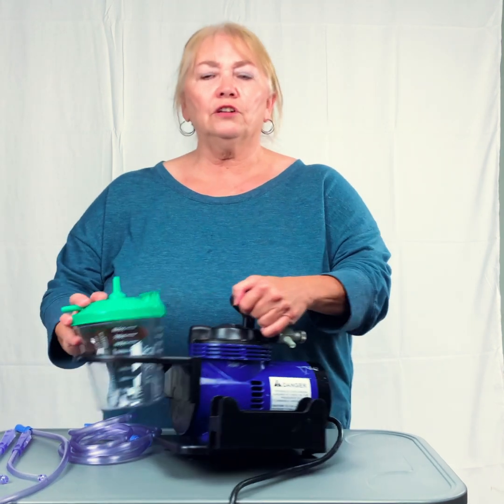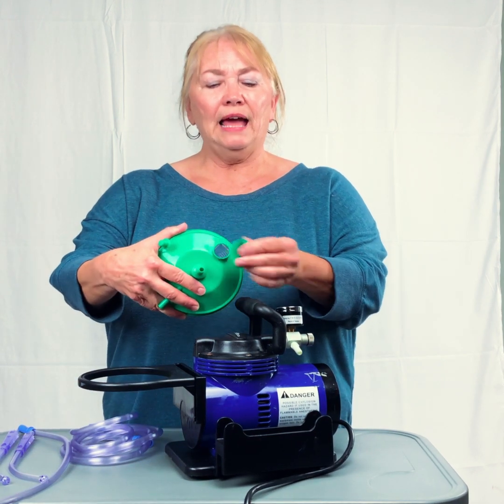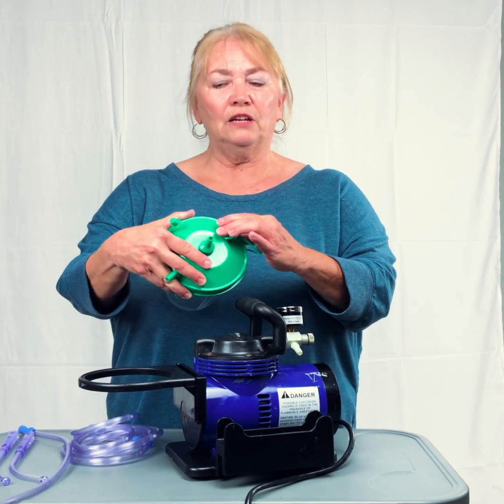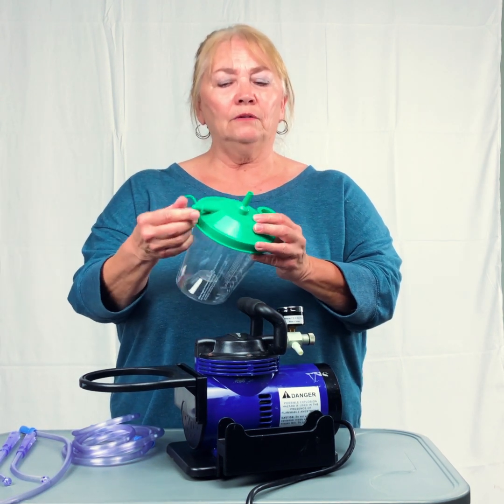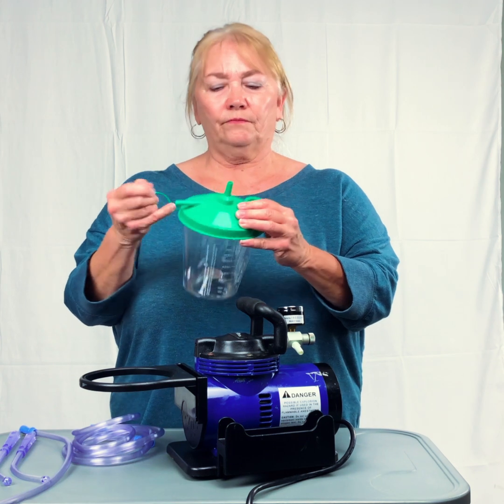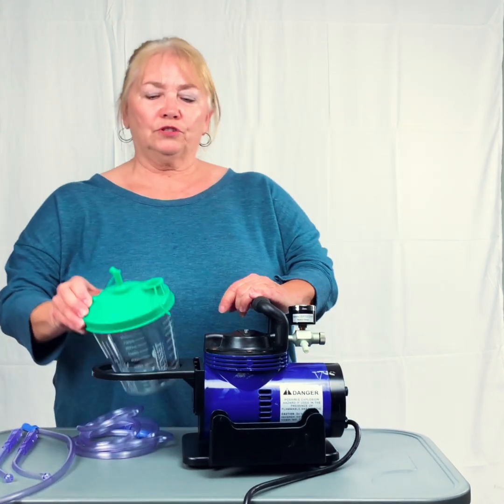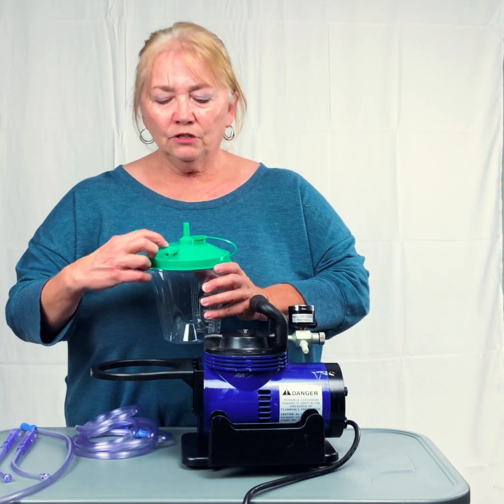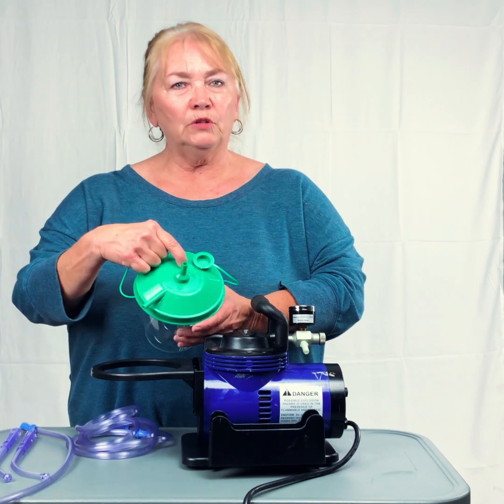So your canister goes in the holder. This canister top has a big cover. That goes in the big hole. The small one, if I'm throwing it away, would cover one of the others. The lid of every canister has pictures. One shows the flow to the patient, the other one to the machine.